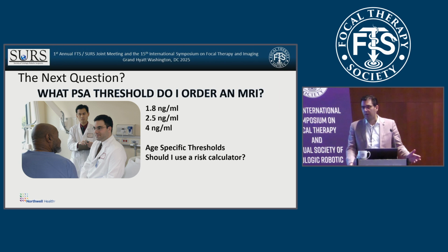I love this picture. This is when Dr. Pinto was early at the NIH. And what threshold do I order an MRI at, if you ask Dr. Pinto? Using the Göteborg study, you really have to take into account there are some age-specific PSA thresholds.